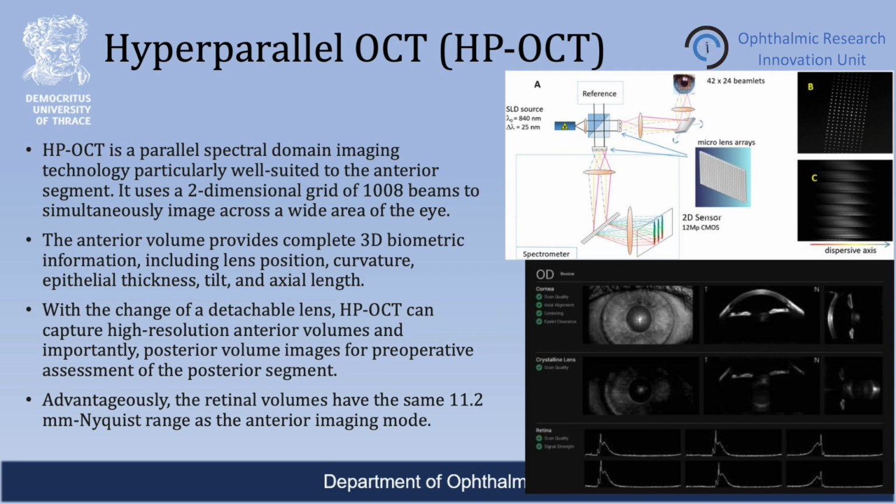Advantageously, the retinal volumes have the same 11.2 mm Nyquist range as the anterior imaging mode.